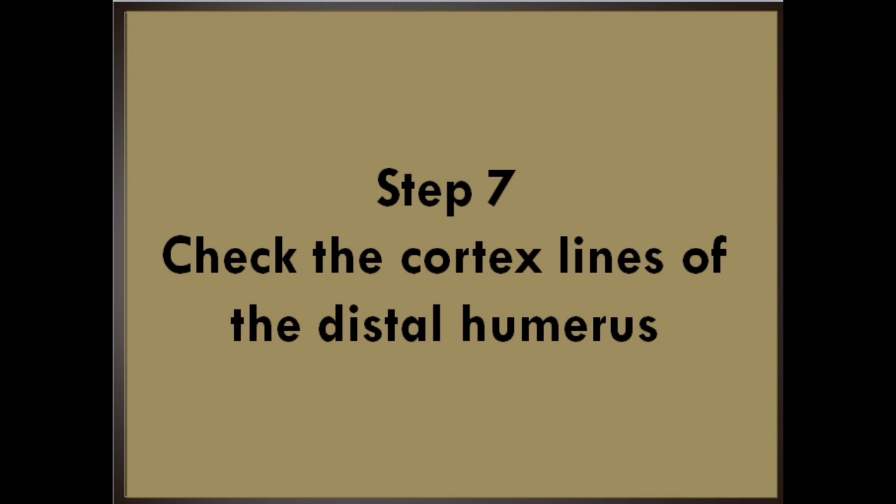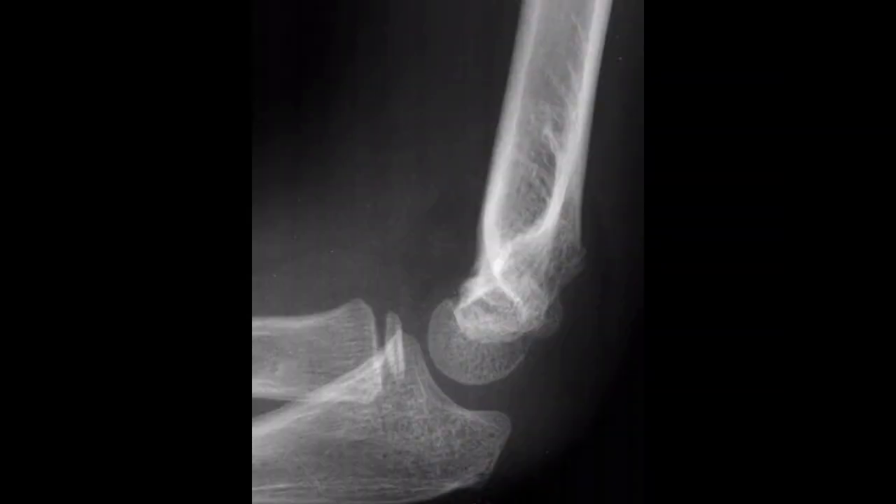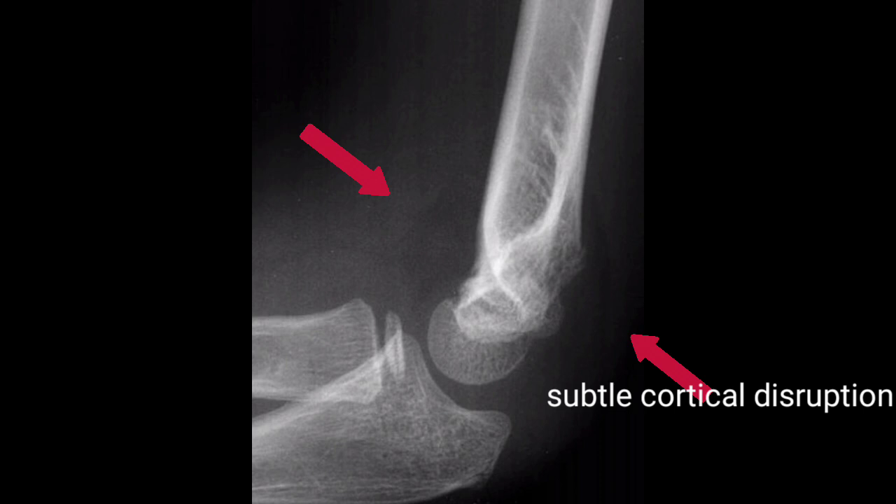Step 7: Check the cortex lines of the distal humerus. Look for any disruption of the cortex on the anterior or posterior humeral borders. This would usually be accompanied by fat pad signs or displacement of the anterior humeral line. In this radiograph, the anterior humeral line intersects the anterior third of the capitellum, while the radiocapitellar line is intact. There are prominent sail and posterior fat pad signs, and on careful inspection, you can see the subtle cortical disruption along the posterior aspect of the distal humerus.